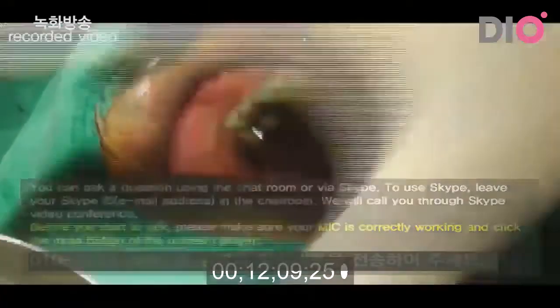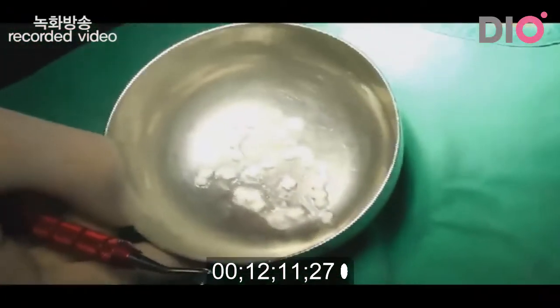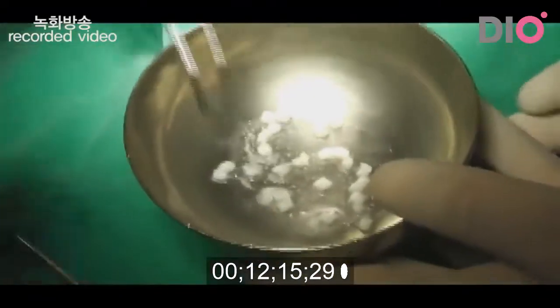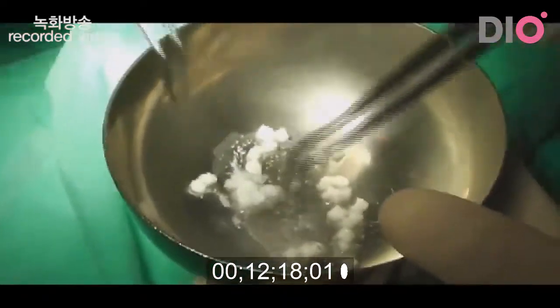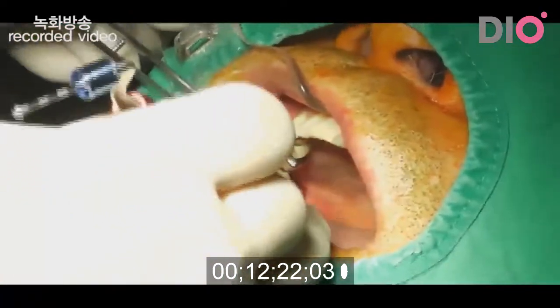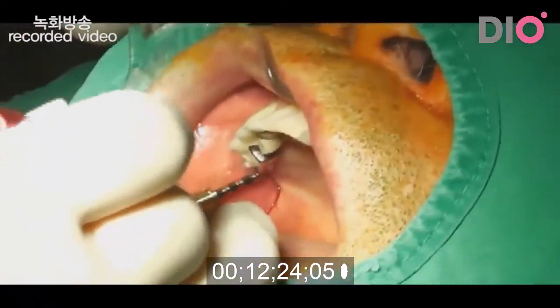This one is the collagen sponge. The collagen sponge is cut into small pieces, and I place this one in the sinus cavity. In the second molar area, I'll place this one.